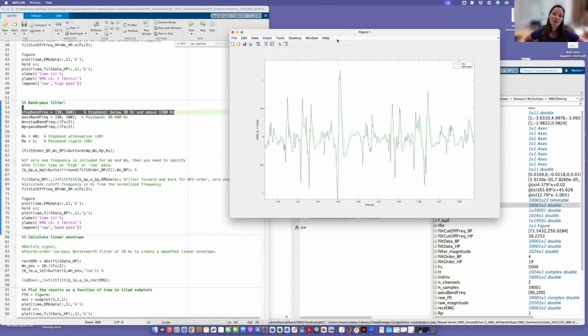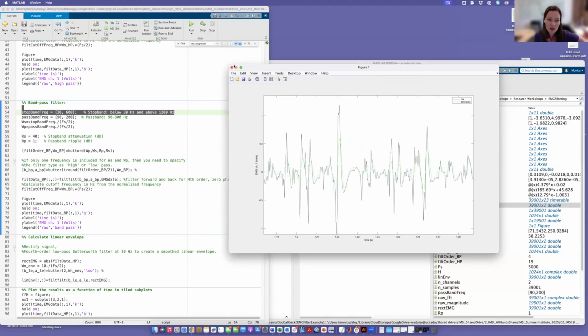But there are real higher frequency characteristics in force data, for example, around heel strike impact that actually do have some higher frequency components. And so when you're specifying your filters, if you're doing force data, you need to be careful that you look at your filter settings carefully, that it's not getting rid of some of the real force data in the signal that might be relevant to your question, depending on what kind of question you're asking.